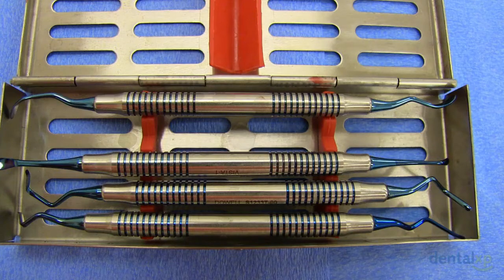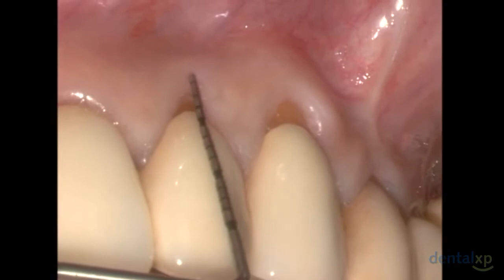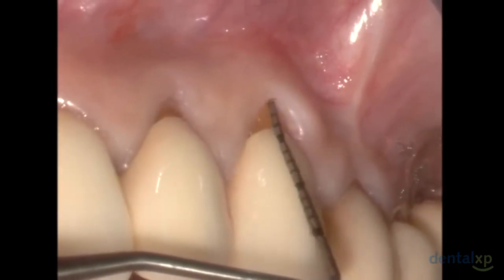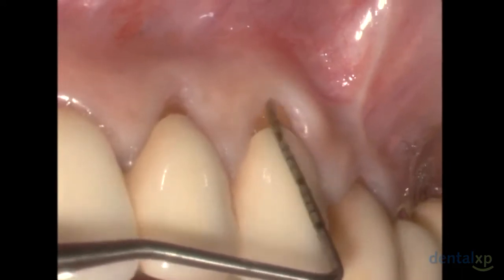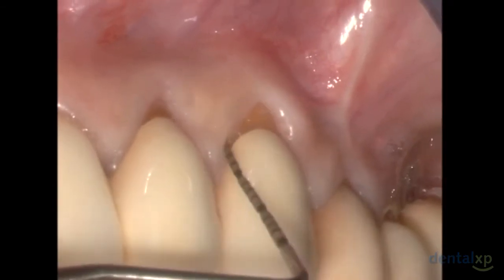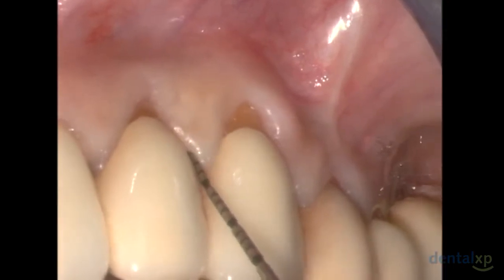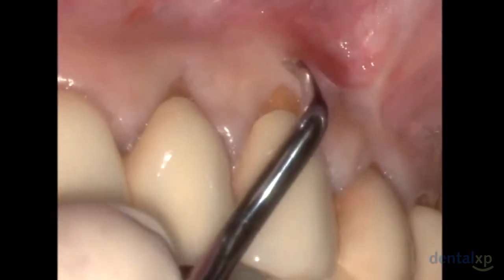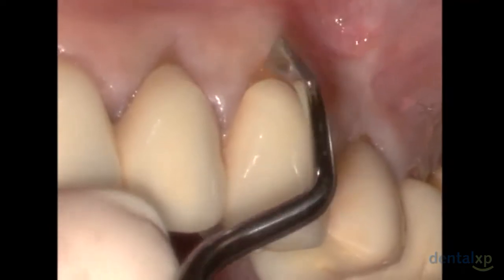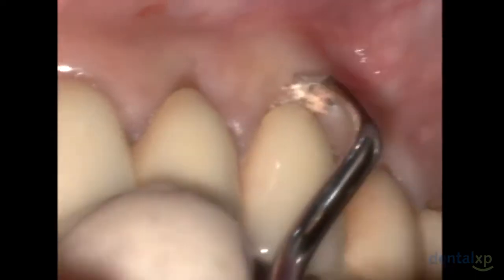Today we're going to utilize the VISTA technique, the vestibular incision subperiosteal tunnel access technique, which was first proposed by Dr. Homayoun Zadeh. Here we're probing the areas, approximately 2 to 3 millimeters, and finding out through bone sounding where the remaining bony levels are, both labially and interproximally, that provide us with the proper Miller or PD Miller classification.